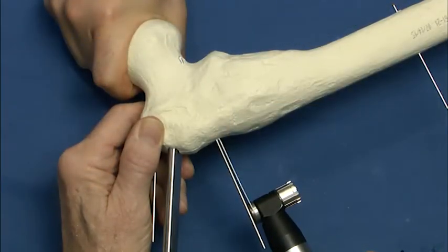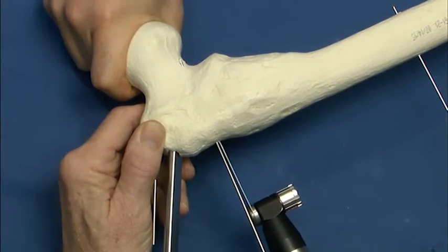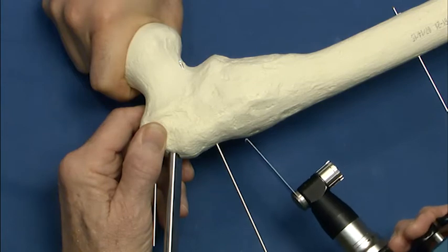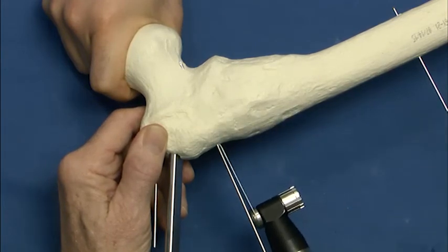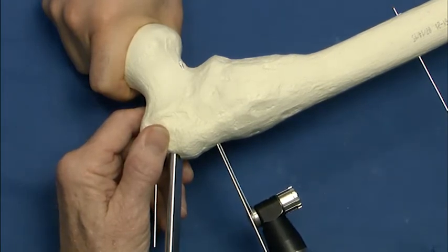All right, so we're going to cut the transverse component of the primary osteotomy here. I think it's just fine to cut on the K-wire. It takes away a little bit of your measurement error possibilities. There are different ways to do this. If you are only going to do a single plane of correction, it's much better to come down with your other reference and complete this partially to here and then come across here. Now the problem with this is that we're going to use our transverse osteotomy to compensate for rotation. So we're going to do the transverse, complete it, derotate, and then take the closing wedge.